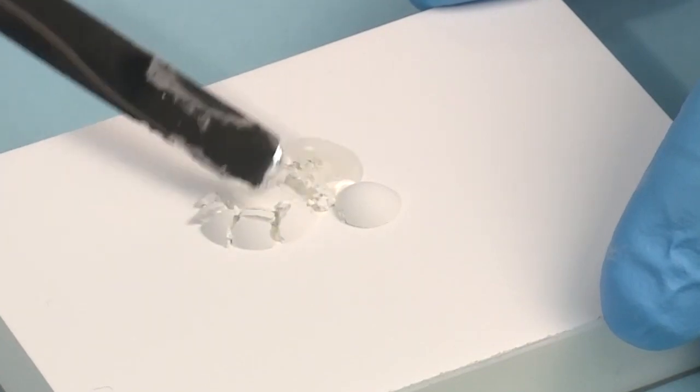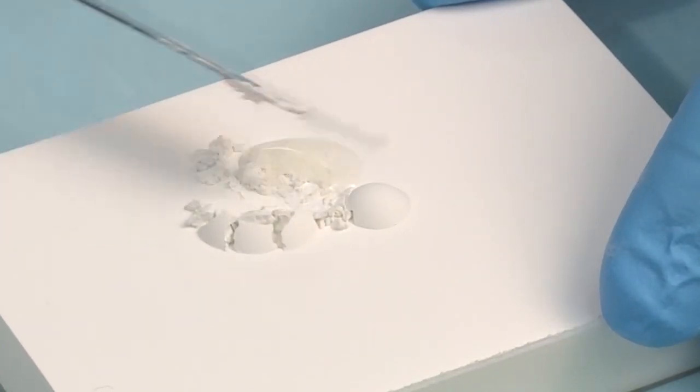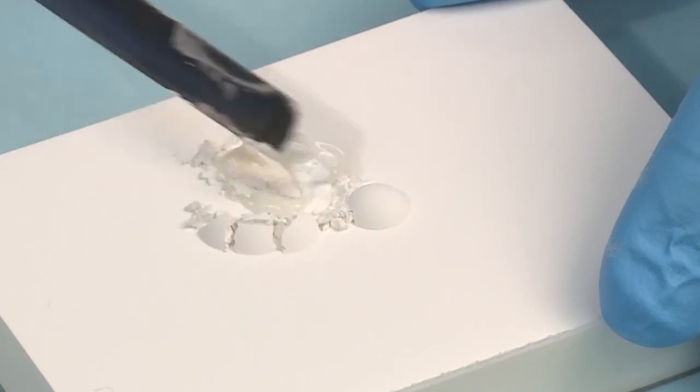To reach the ideal consistency, add the powder to the gel gradually, taking care to hydrate all the particles of the powder.